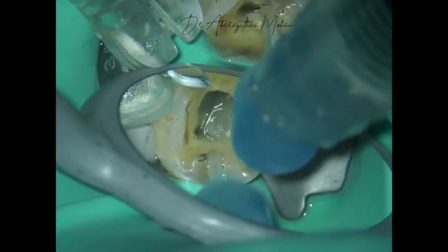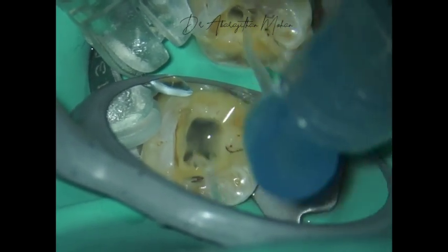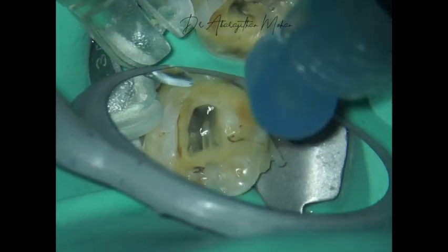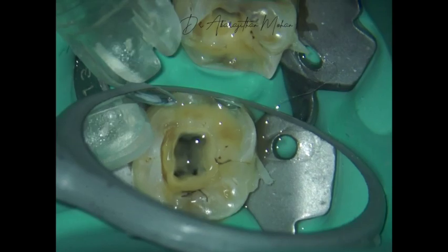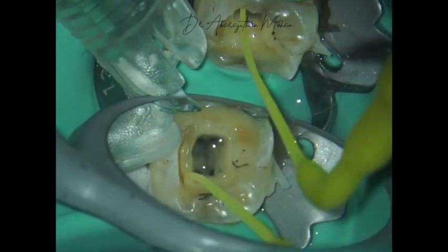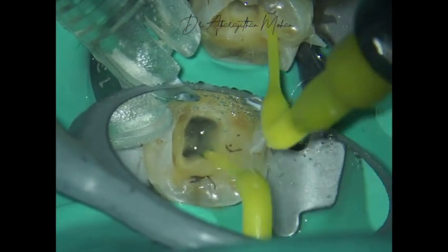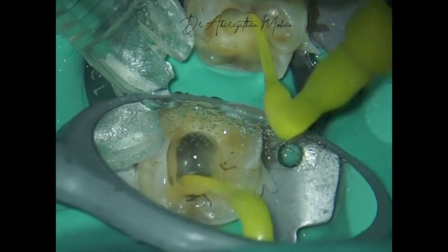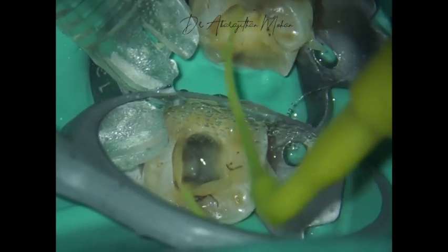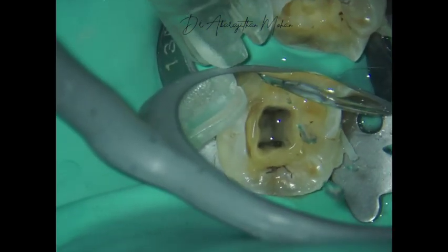We call this 'passive' because here I'm not doing continuous activation — I'm doing passive syringe irrigation, following which the canal and pulp chamber is filled with the irrigant, and then I use the activator in a passive mode. Here I'm using sonics — that is, airsonics — which is my personal choice, though you can still use any sonic device as well. Remember: when you use sonics you need to use it for a little extra time.